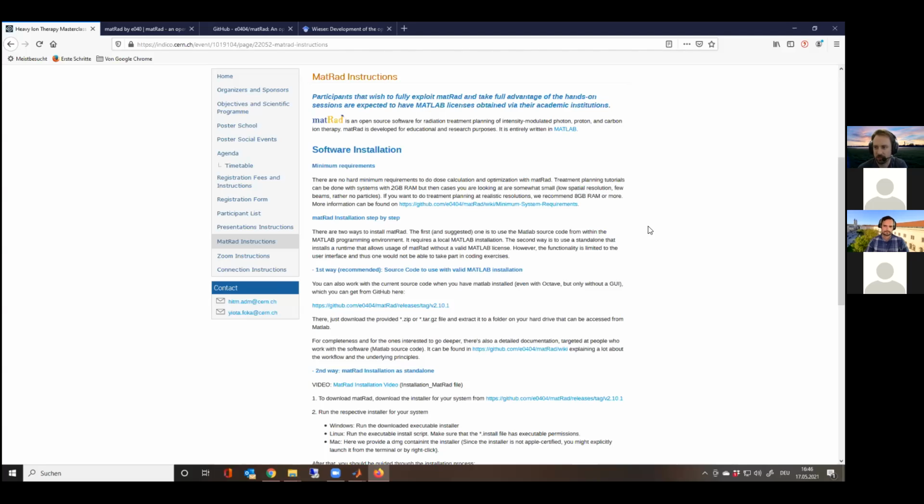If you have a very slow processor, like I still remember having a computer which had a display that showed megahertz, and in turbo mode it was 100 megahertz, and in normal mode it was 10. So hopefully you don't have such a system. But in principle, it scales the time it takes.